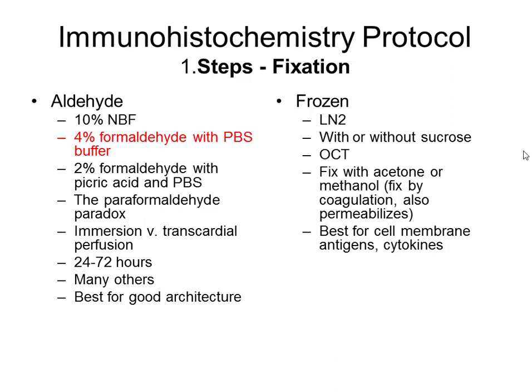Of course, a gastrobiopsy, which is several millimeters in size, must be in the formalin not more than 24 hours. But if it's a big part, 1 to 3 centimeters in size, for example from a leiomyoma, it may be fixed longer, from 24 to 48 hours.